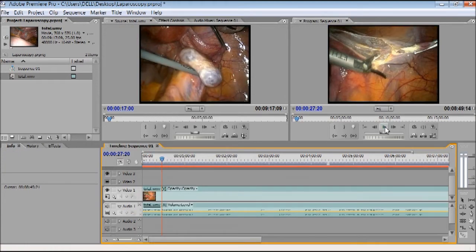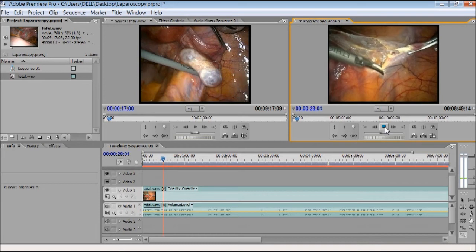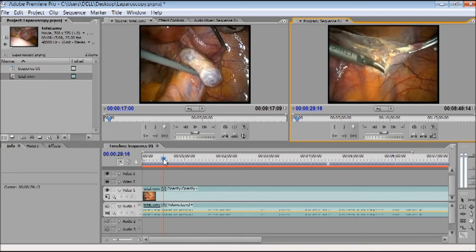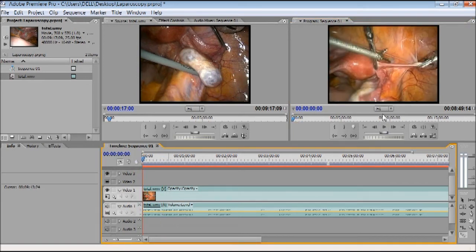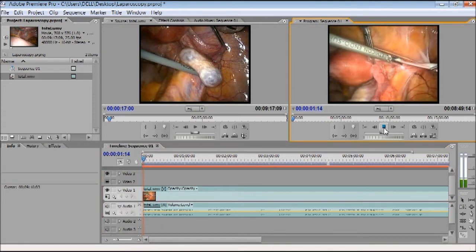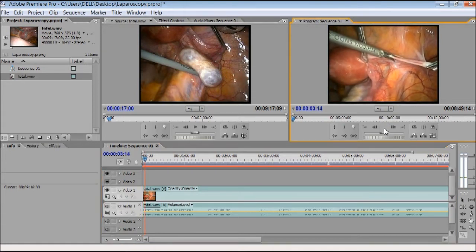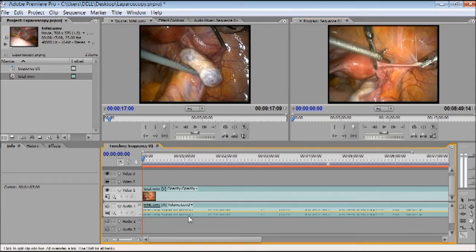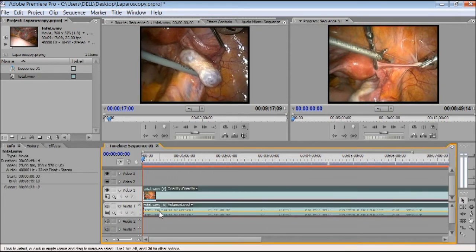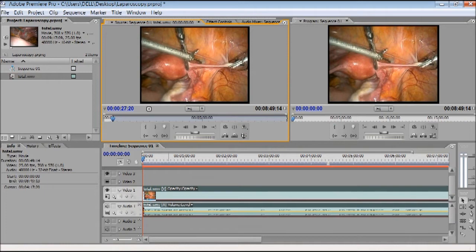Now only the surgery part remains — the initial diagnostic part is gone. You can see the round ligament is grasped with an atraumatic grasper. Suppose I don't want the sound of this video. I will take the arrow tool, double-click the clip, and at the top in the middle you have the Audio Mixer.